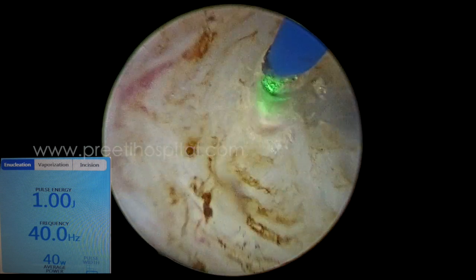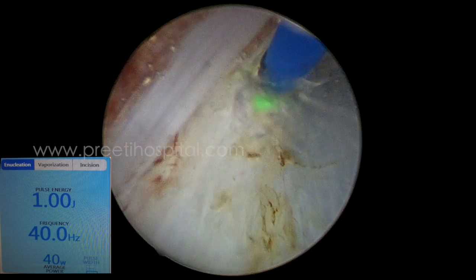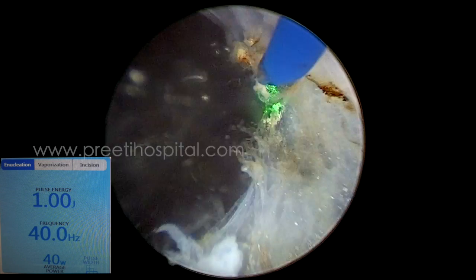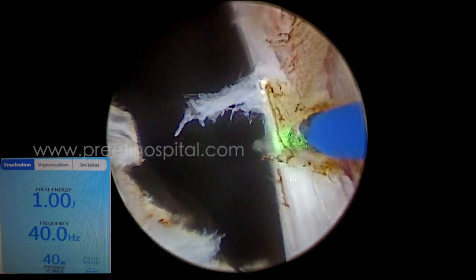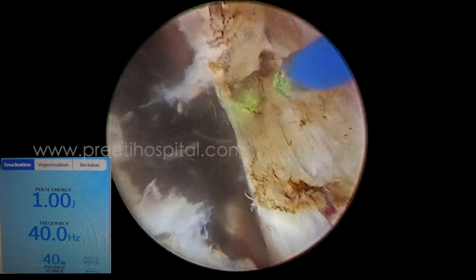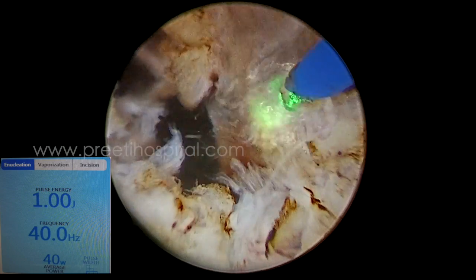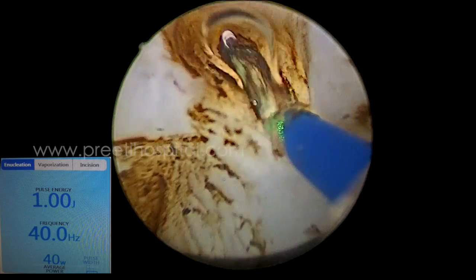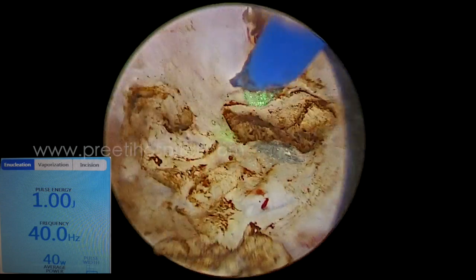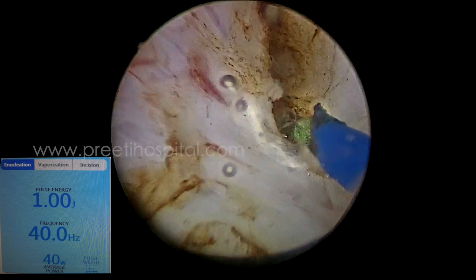We developed the plane retropubically and continuously proceeded from above downward, then entered into the bladder. Now we are sweeping. While sweeping, we went close to the bladder neck and tried to be a perfectionist, removing the entire lobe, almost removing all the bladder neck tissue. During this process we are inside the bladder.